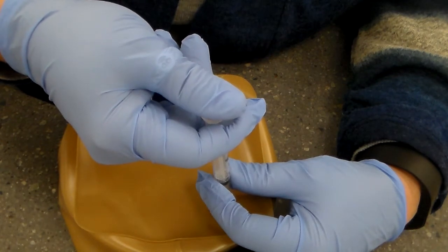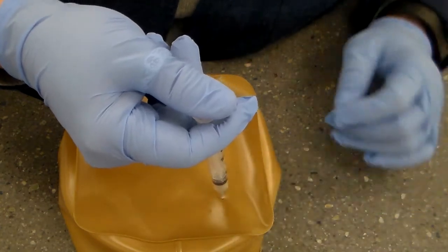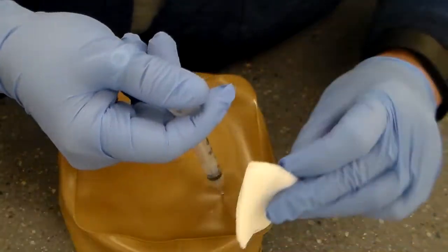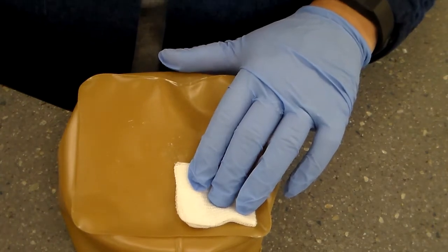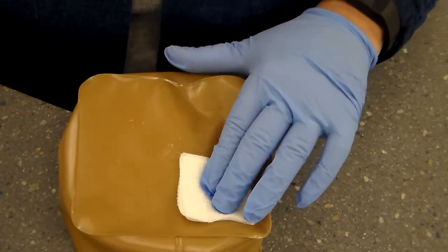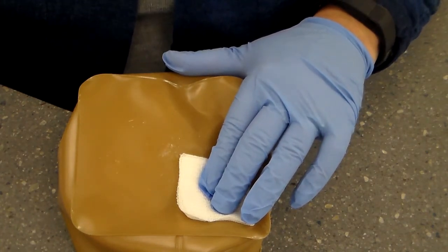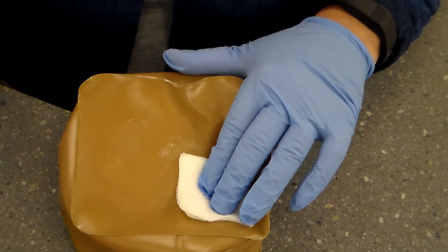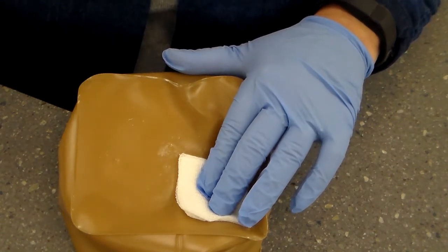You're going to hold again to the count of 10. 1, 2, 3, 4, 5, 6, 7, 8, 9, 10. Now we're going to withdraw and hold, not rub. There's no rubbing. Just hold the site. We're going to put the safety on our needle and put that in the sharps container.